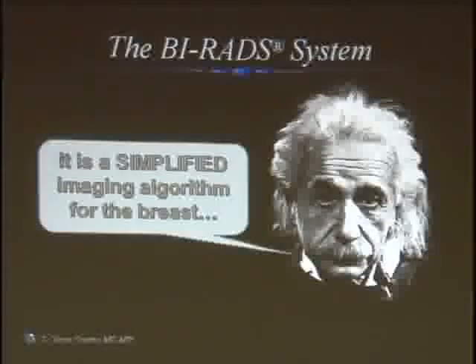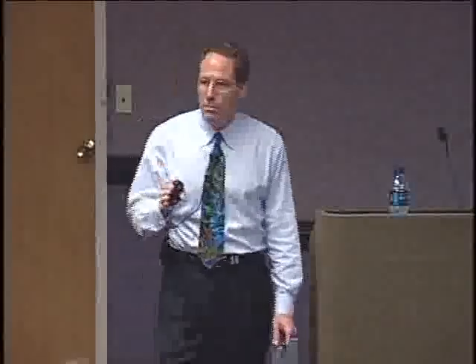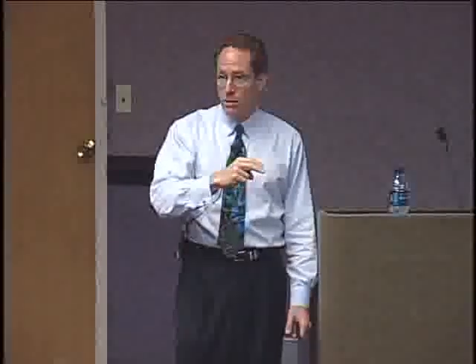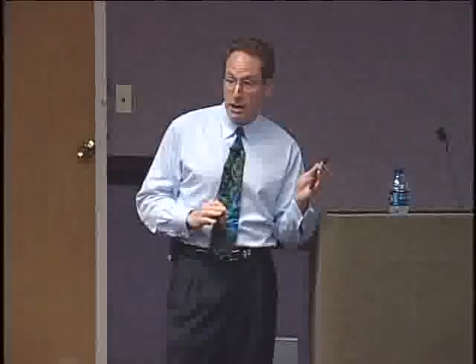This system was designed to simplify the process of walking through the imaging workflow. Okay? It tells you what we think in an unambiguous way, a number, not words. It tells you by number what the next step is. Typically, it tells you what the timeline is to that next step as well. So it's designed to take it and make it easy. No other imaging does this. Abdominal, neuro, ortho, nothing. This is special to the breast. Okay, so this hopefully makes it clear.